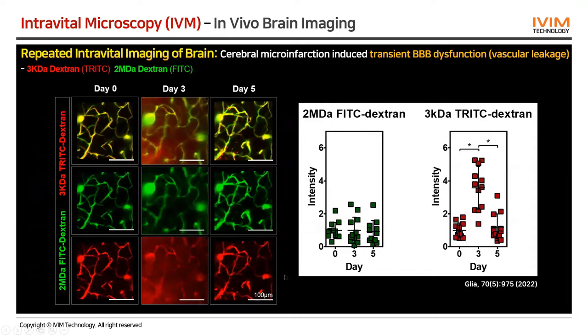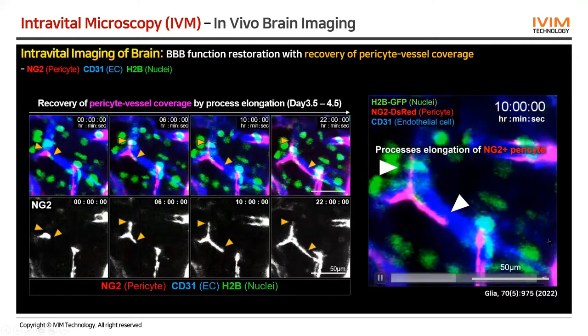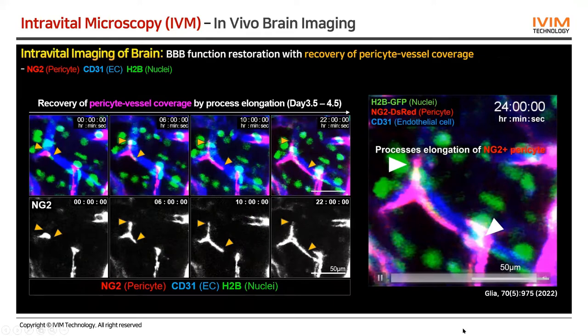So you can see the physiological change, like blood vessel leakage, and you can also see the cellular level changes at the same time period, as shown here.